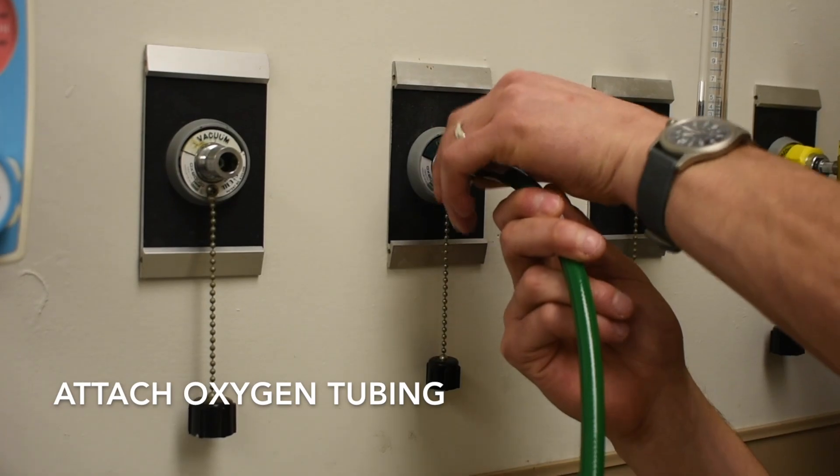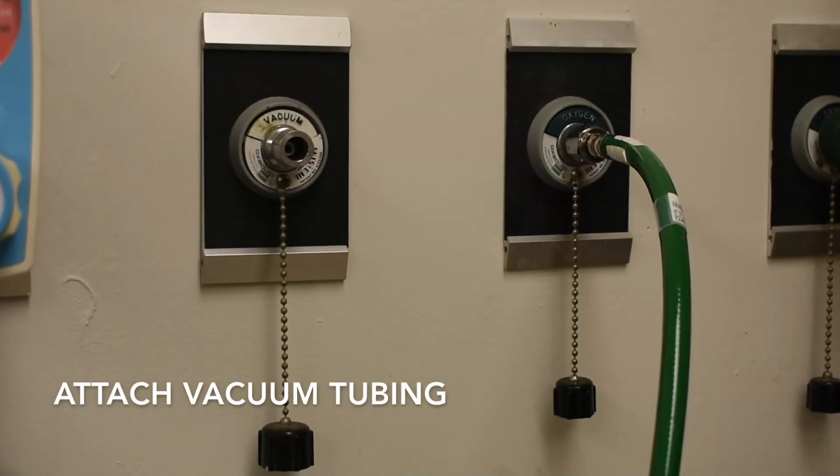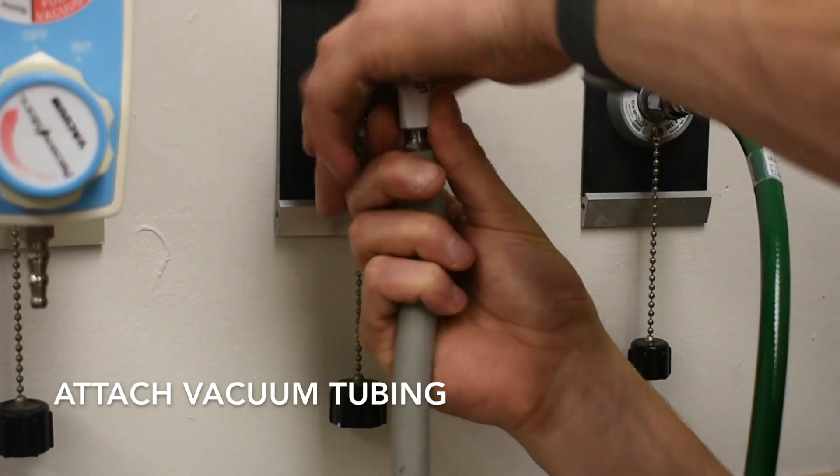Next, attach the green oxygen tubing to the green port in the patient's room. If there is an oxygen tree attached to the wall, this can be unscrewed from the wall. Repeat the same process for the white vacuum tubing.